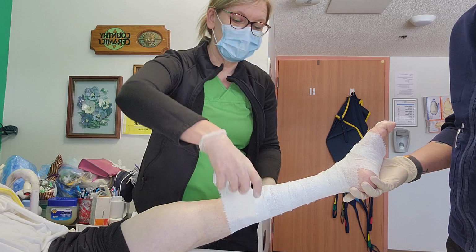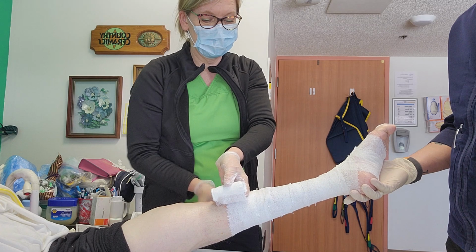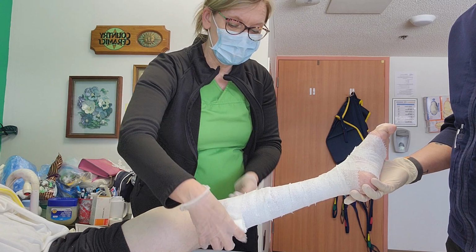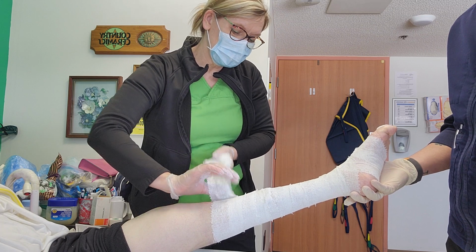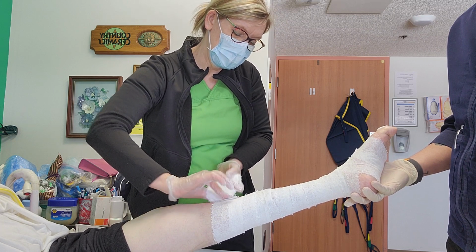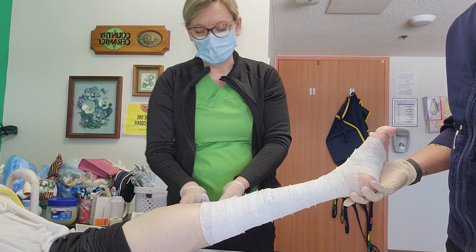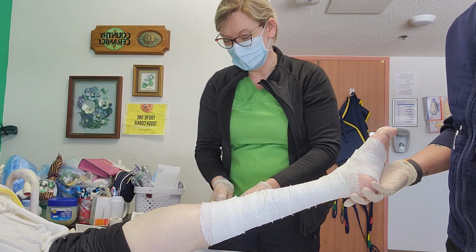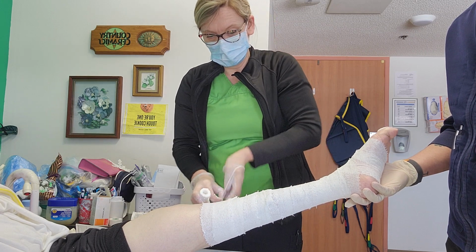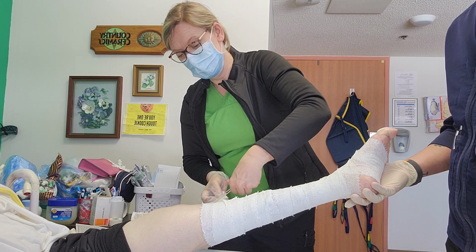So again, the pleats, we're just up, bend back, and we're doing that all the way up the leg. We usually do a 50% overlap so that it actually covers the layer before, so then you have lots. So as with all compression, two fingers below the knee is where we're going to actually cut, and it is pretty messy, so I'm going to take my glove off. I'm going to cut here.